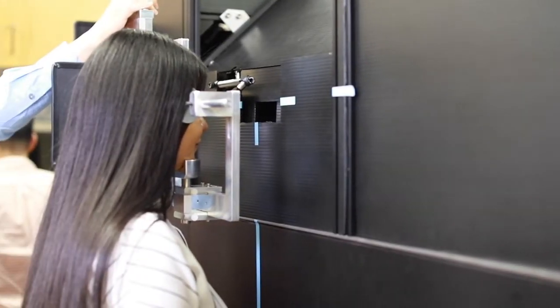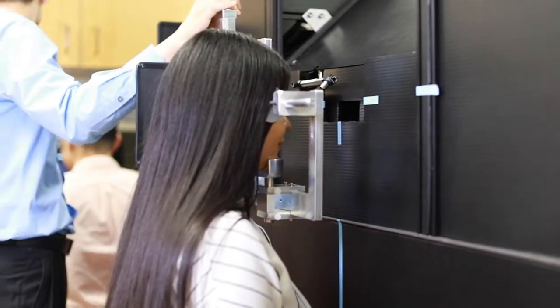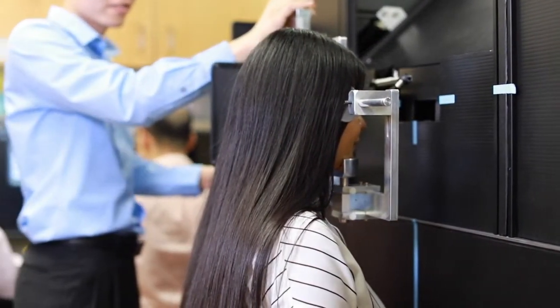To acquire these images, we use a technique called adaptive optics, which allows us to image at cellular level resolution inside the eye.